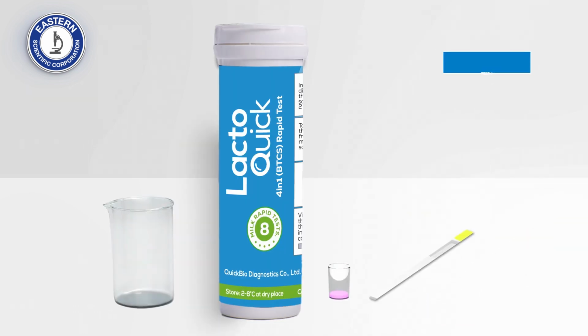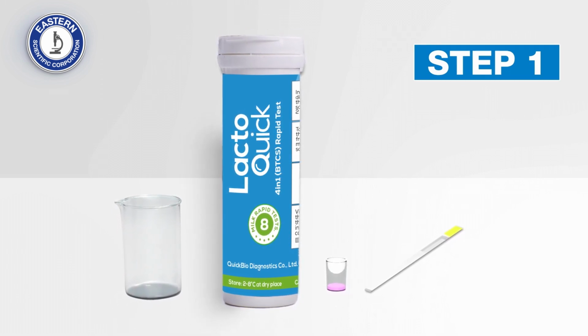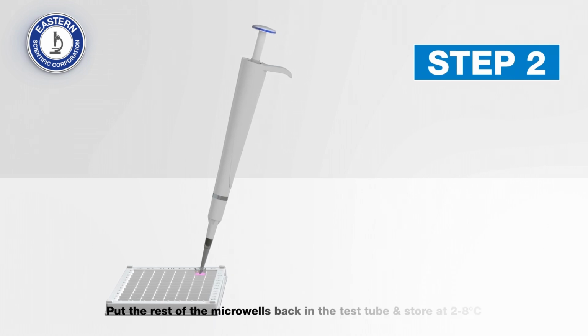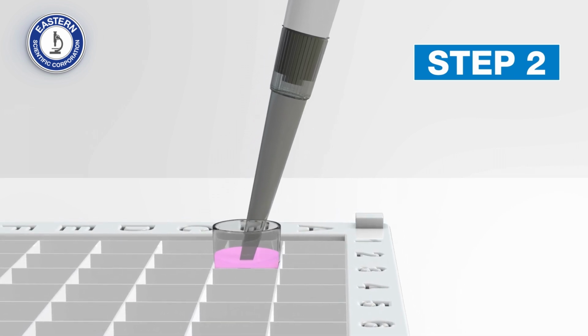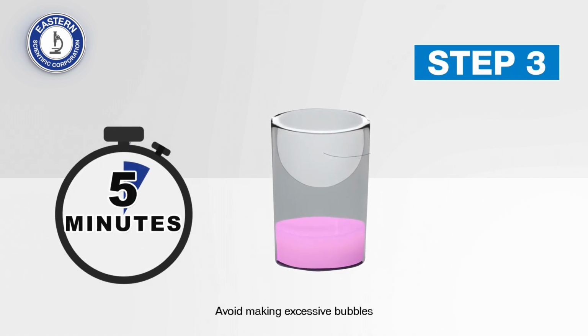Step 1. Take required number of microwells and dipsticks from test tube. Step 2. Pipette 200 microliters milk sample into the reagent microwell and mix well by pipetting up and down 5 to 10 times. Step 3. Incubate 5 minutes at room temperature.